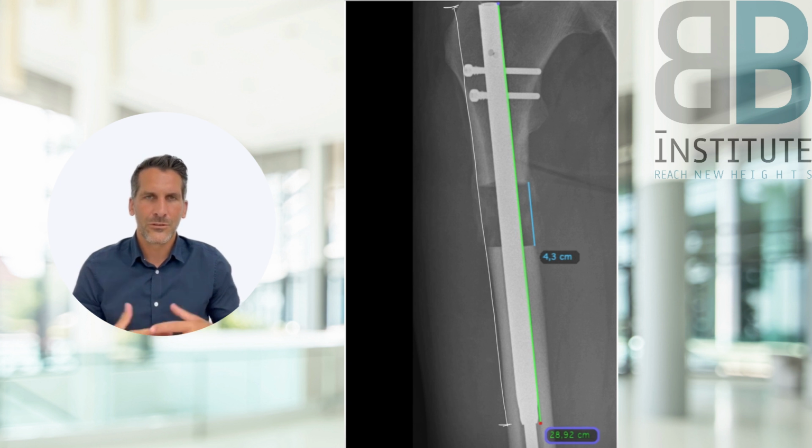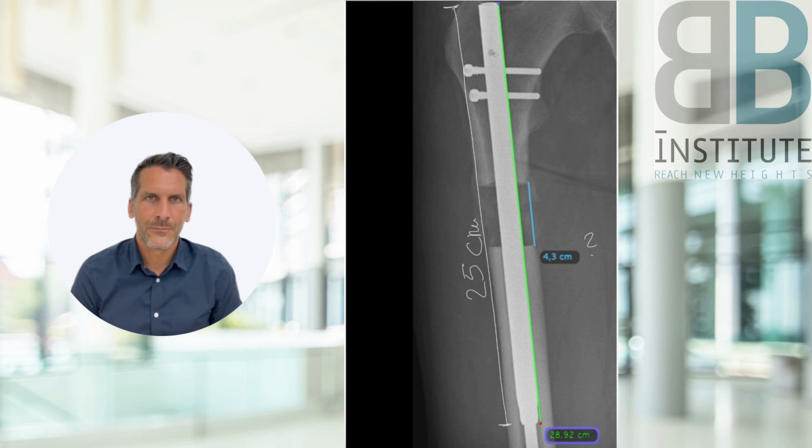This cannot work with solid nails such as those used in the LON or with curved nails because the projection shows an incorrect length. If we now look at this clinical example, the patient usually had his X-ray taken about 6 to 8 weeks after the extension began. The clicks were documented very precisely via the app and show an extension distance of exactly 3.71 centimeters. Now the radiologist has measured the gap at more than 4 centimeters, and the patient contacts us worried because he is sure that he has documented the clicks precisely.